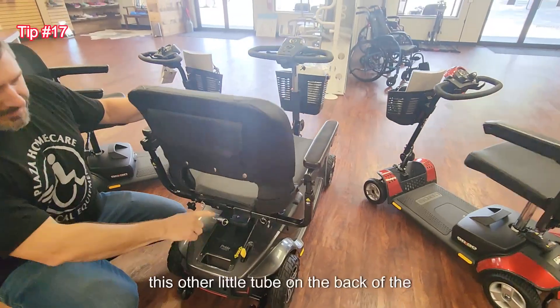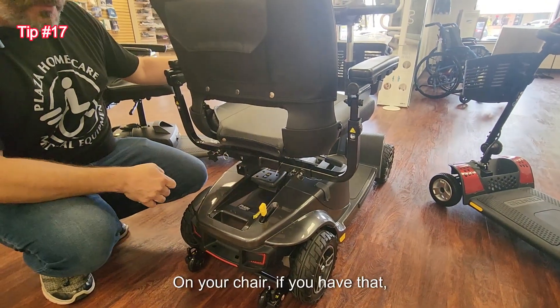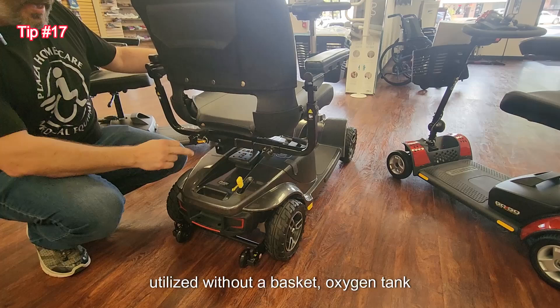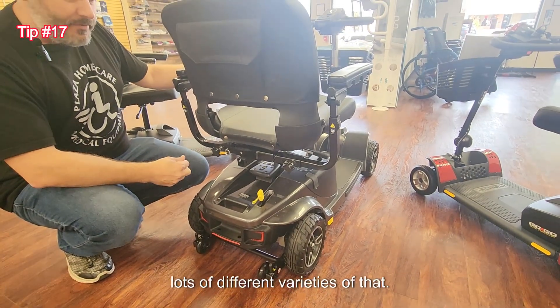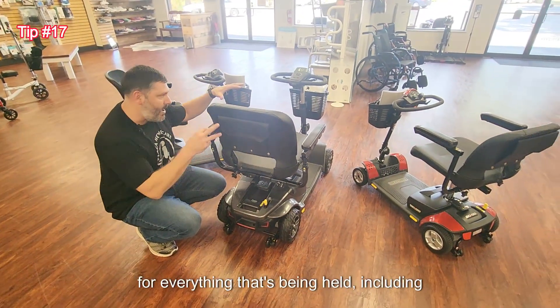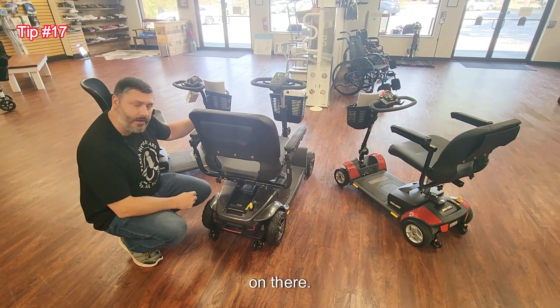This other little tube on the back of the scooter or chair, if you have that, it's called a trailer hitch. It's not designed to pull a trailer, but it's designed for accessories that can be utilized without a basket — oxygen tank holder, walker holder, cane holder, lots of different varieties. Just remember when using this, the overall weight capacity of the scooter is designed for everything being held, including the patient and all accessories they have on there.